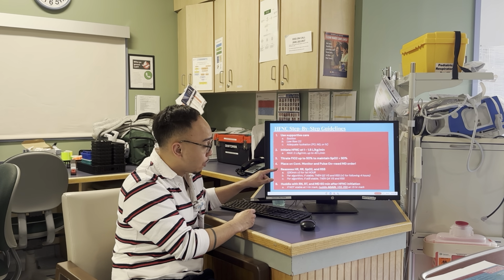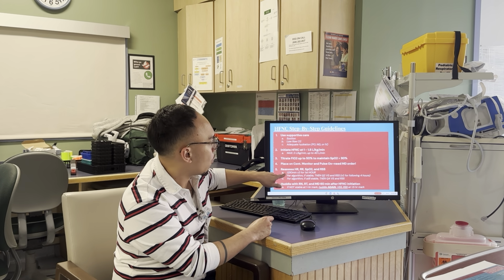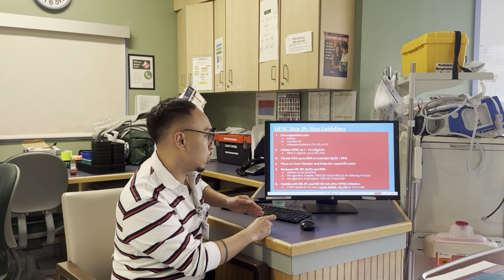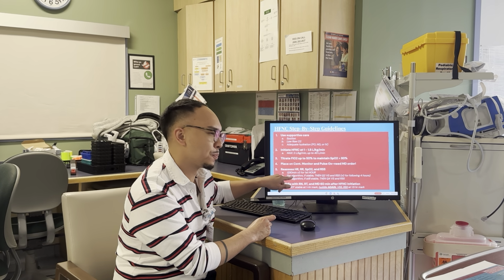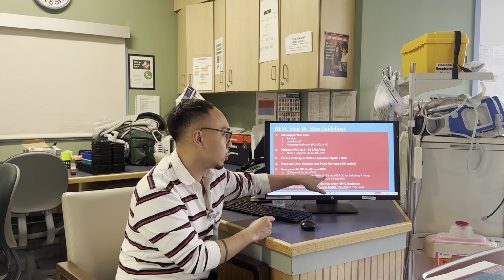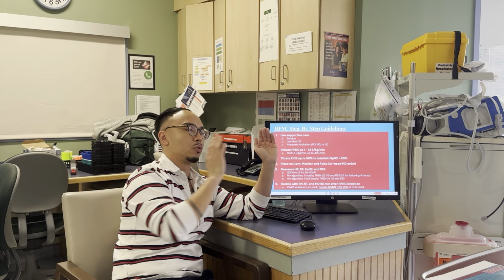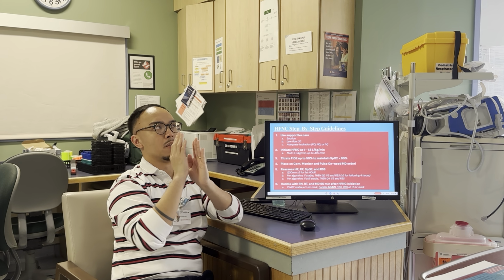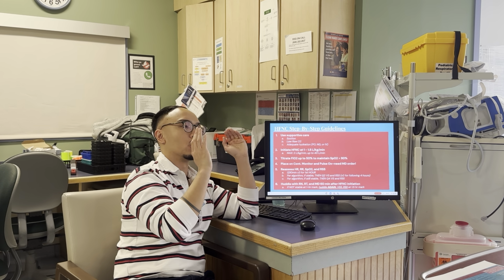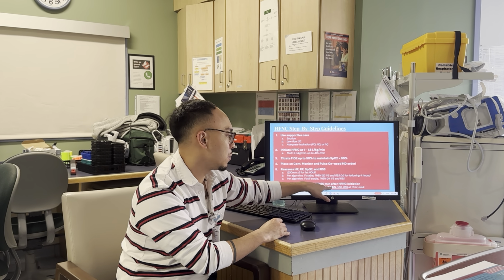And then in terms of timeline of reassessing, you're going to reassess the heart rate, respiratory rate, pulse ox, and RSS at a certain time frame. So for the first hour, you're going to do it once at the start of the high flow. You're going to do it at the 30-minute range, then you're going to do it at the 1 hour range. So 2 Q30s. Does that make sense? Yeah. And then per the algorithm, if they're stable after that first hour, after starting high flow, then you're going to do Q2 vitals and Q2 RSS. So basically 2 Q2s for a 4-hour period. So the first hour, 30-minute, 30-minute. Then the following 4 hours is a Q2, Q2. Then if they're still stable, like what we have now, you're going to go to Q4 from then on, all right? And then the next step, huddle with the RN, RT, and MD 60 minutes after initiation of high flow.